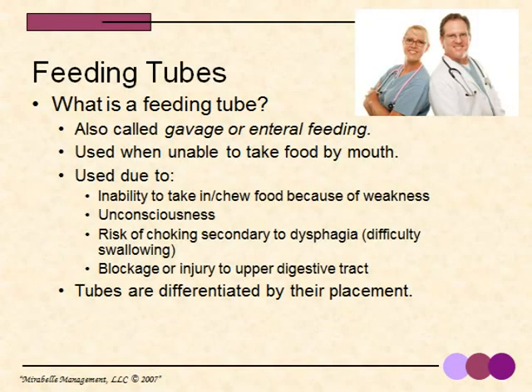The state of being fed by a feeding tube is called gavage or enteral feeding. Gavage means feeding with a stomach tube or with the tube passed through the nares, the pharynx, and the esophagus into the stomach. Enteral means within or by way of the intestines.